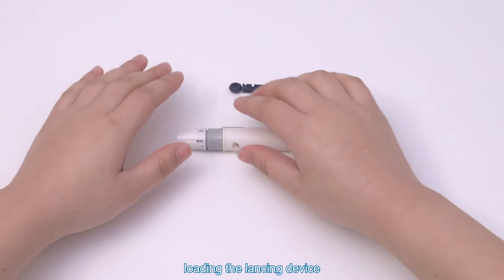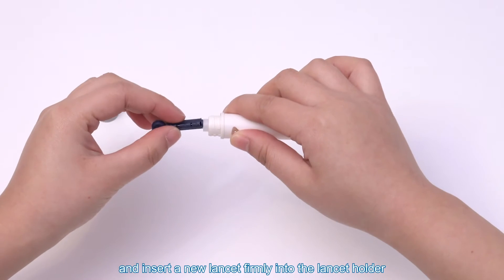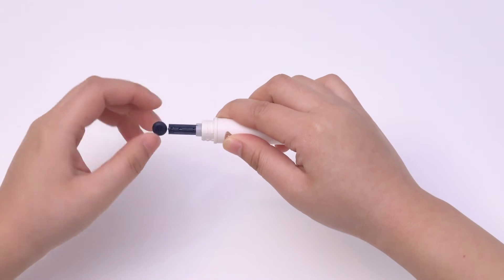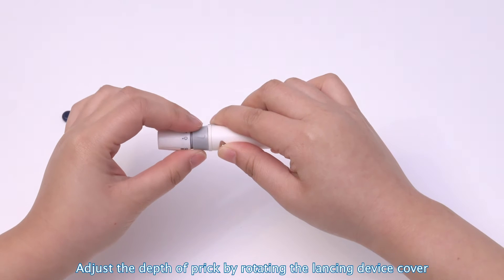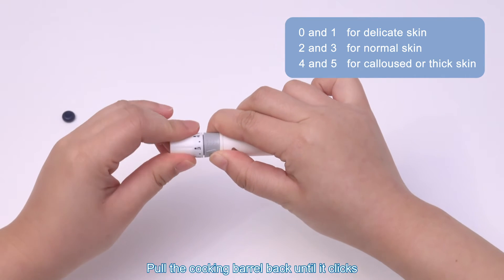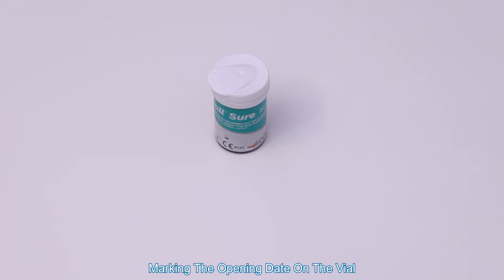Loading the lancing device. Unscrew the lancing device cover and insert a new lancet firmly into the lancet holder. Twist the safety tab off, and screw the lancing device cover back. Adjust the depth of prick by rotating the lancing device cover. Pull the cocking barrel back until it clicks and the button indicator turns orange. The device is now loaded and ready to take a prick.